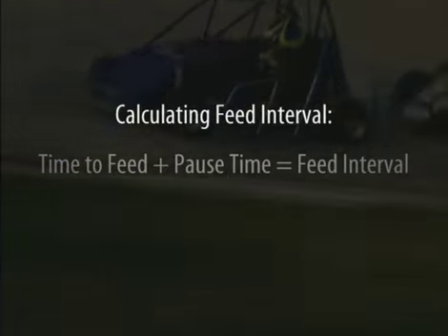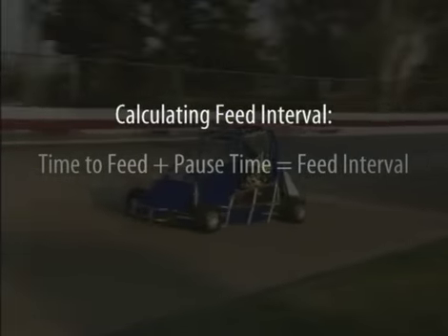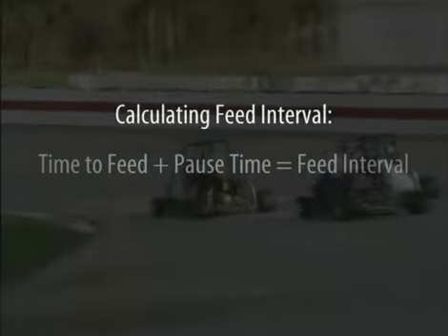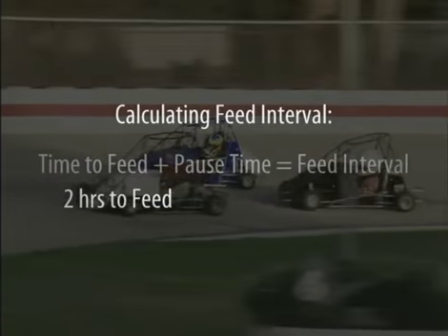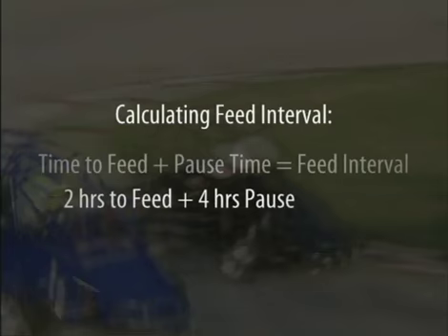The number of hours to be set as the feed interval needs to be the amount of time to deliver the feeding plus the amount of time the pump should pause between the feedings. This means 2 hours for the feeding delivery plus a pause of 4 hours equals a feeding interval of 6 hours.